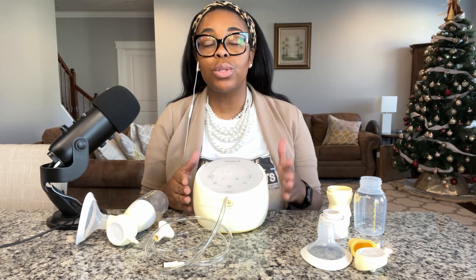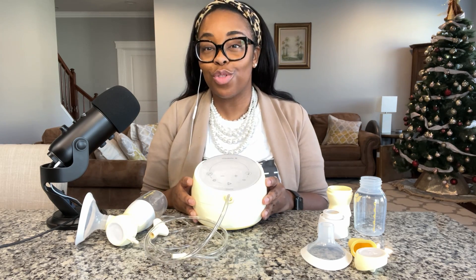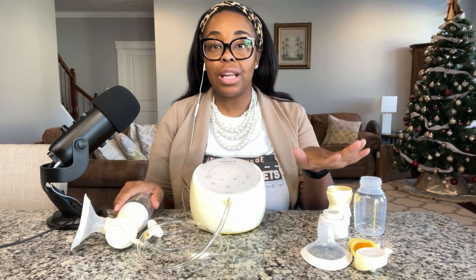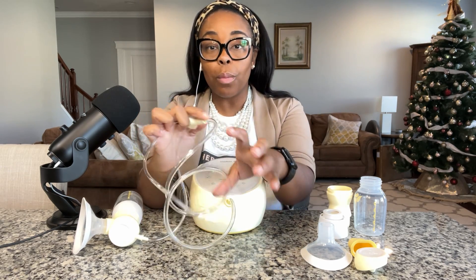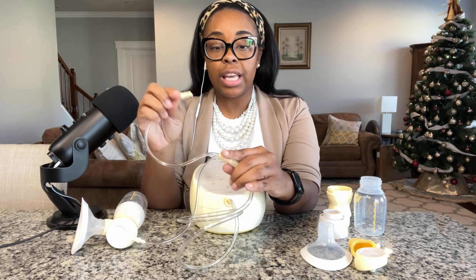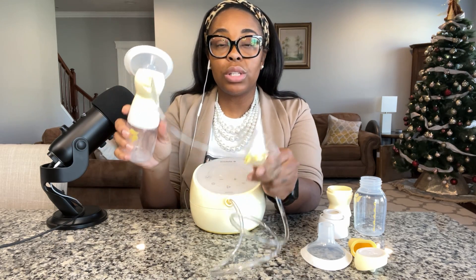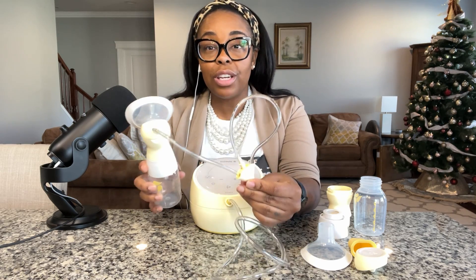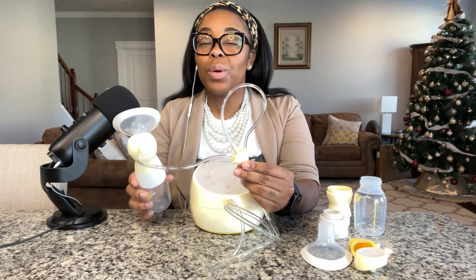On all of my reviews, I talk through how to assemble the pump, the operation of the pump, and my initial thoughts. I want to show you the parts — one assembled and one not assembled. Quick tip: if you ever want to single pump, there's a part in the middle you can plug in to use it for single pumping only. I love showing assembly in my videos because it's just not always intuitive, even with the manual.